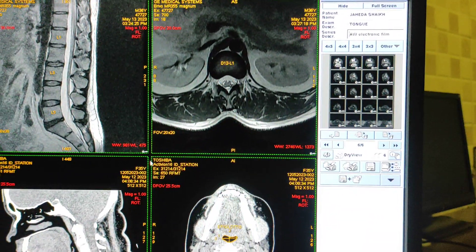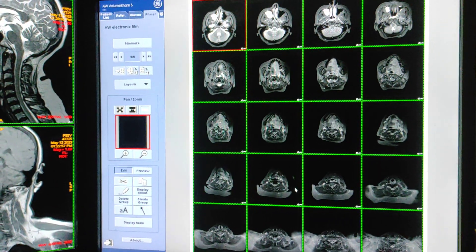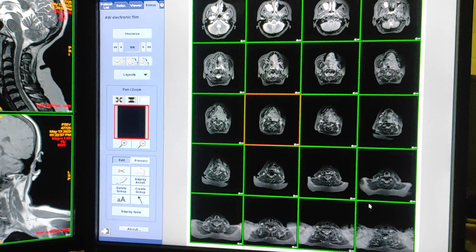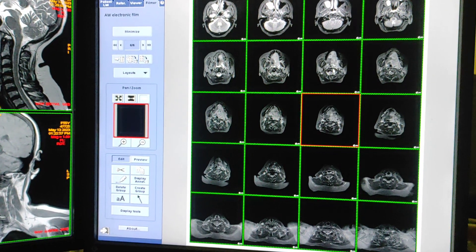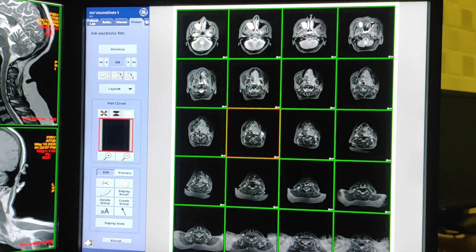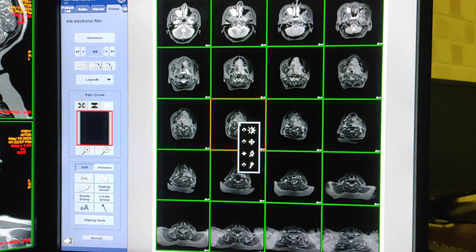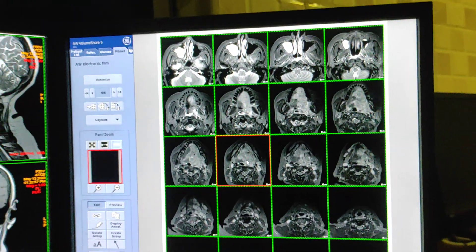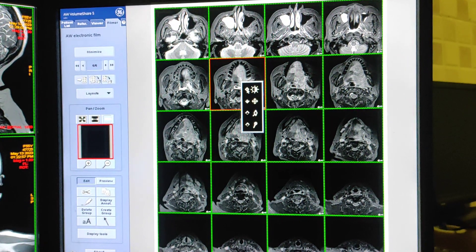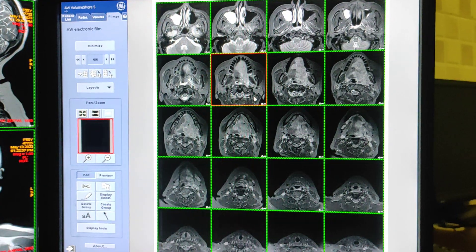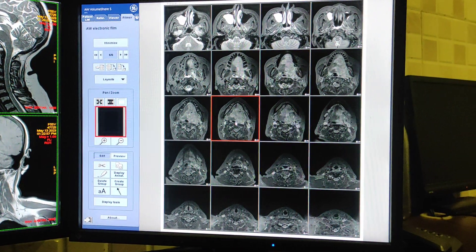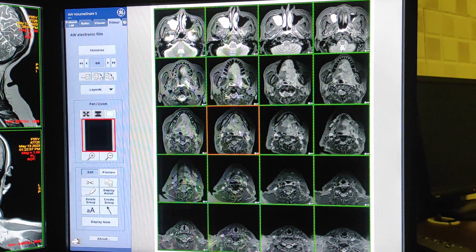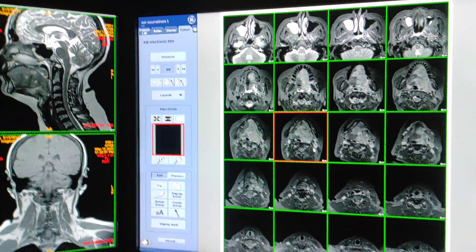For the first film, double-click on the axial STIR sequence. All images should be selected — the green lining shows all images have been selected. Then right-click, click on the tool with scroll bar, zoom the images and edges accordingly, and double-click to select the option to set the level and window. This is our first film: axial STIR.